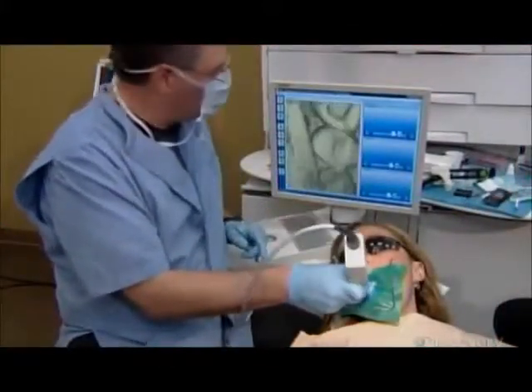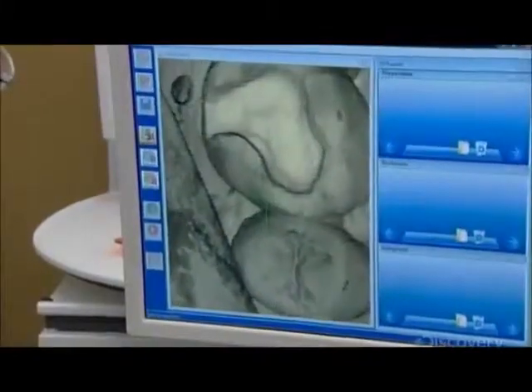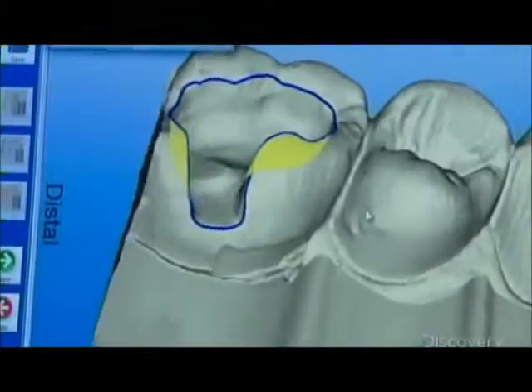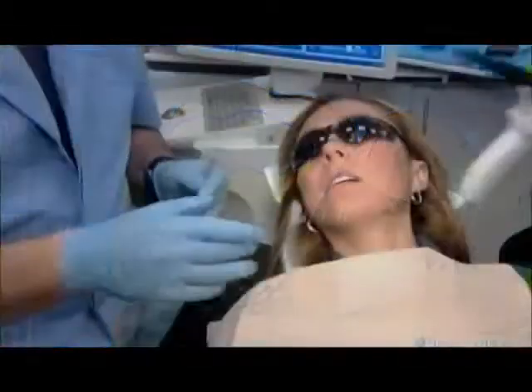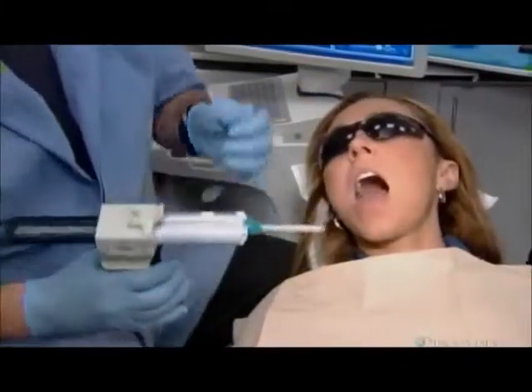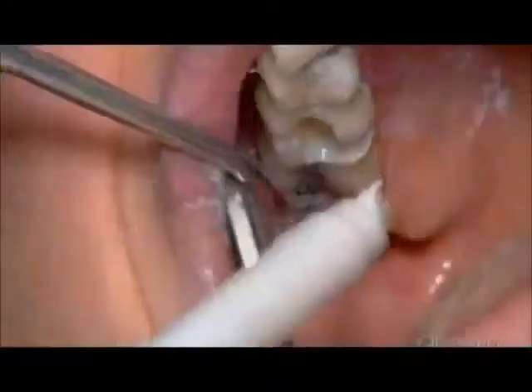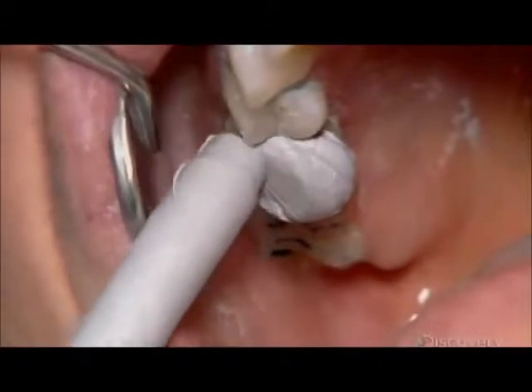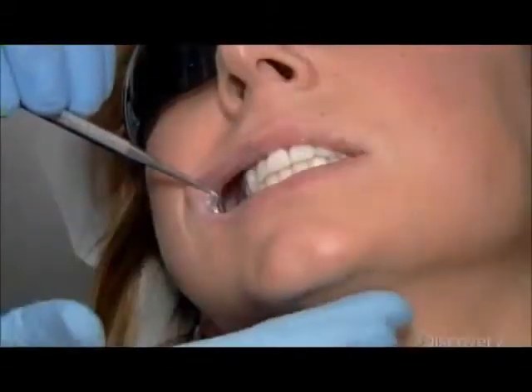He points a high-resolution LED camera at the tooth and downloads the image onto a computer, which converts it to 3D. Next, the dentist fills the cavity with silicone putty. When her teeth come together, they leave an impression in the putty that indicates her bite profile.